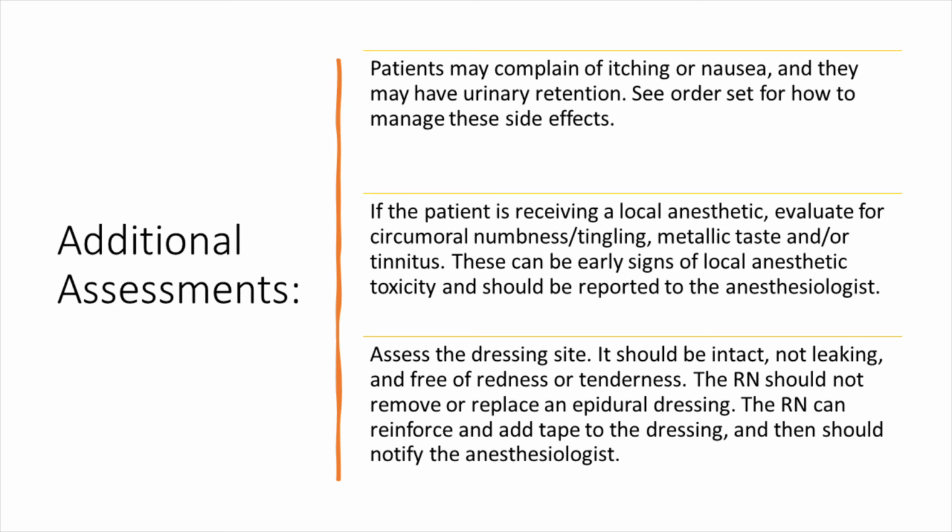Assess the dressing site. It should be intact, not leaking, and free of redness or tenderness. The nurse should not remove or replace an epidural dressing. The nurse can reinforce and add tape to the dressing and then should notify the anesthesiologist. Patients may complain of itching or nausea, and they may have urinary retention. See provider orders for how to manage these side effects.